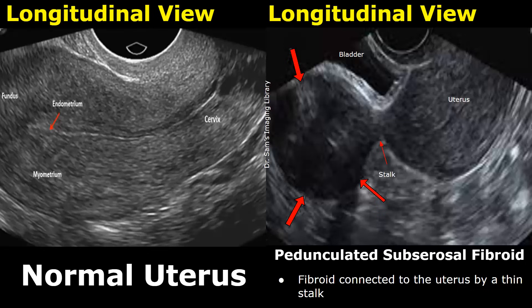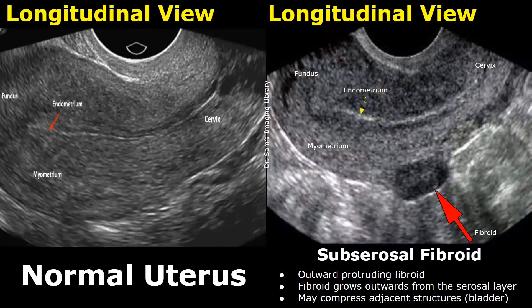Here is another image. We can see a small fibroid protruding outwards from the uterine wall, so this is a subserosal fibroid.